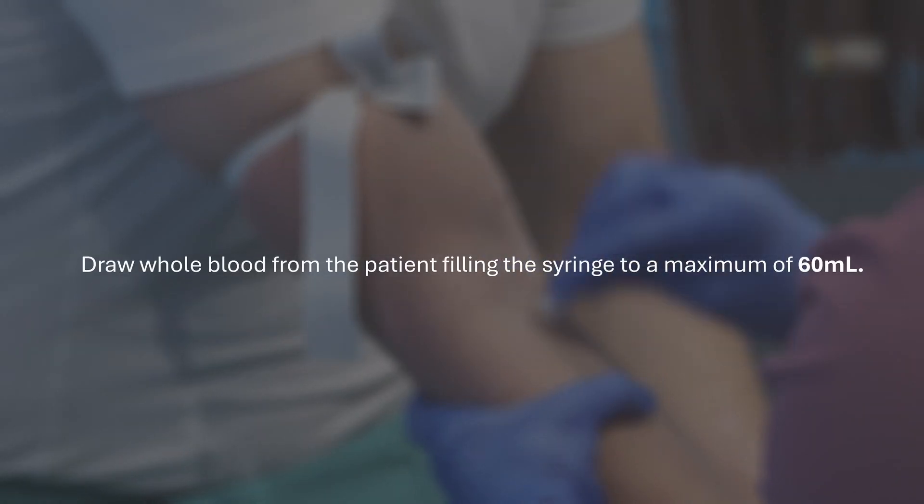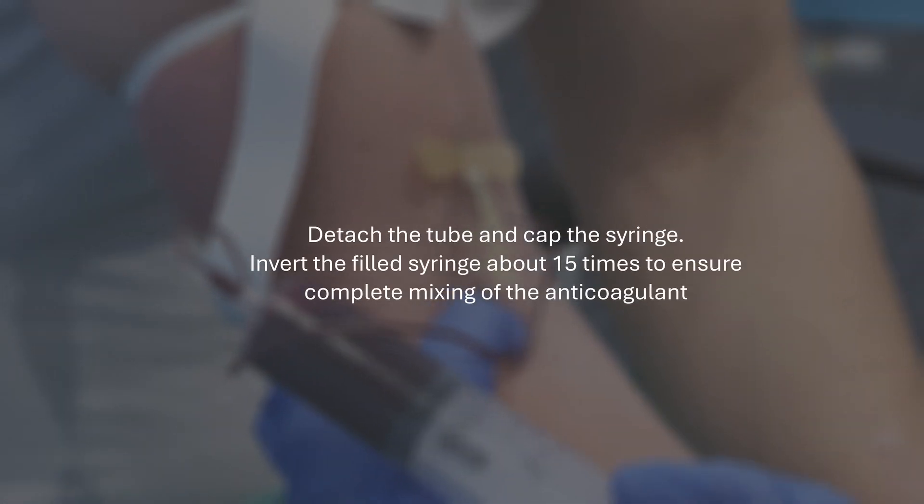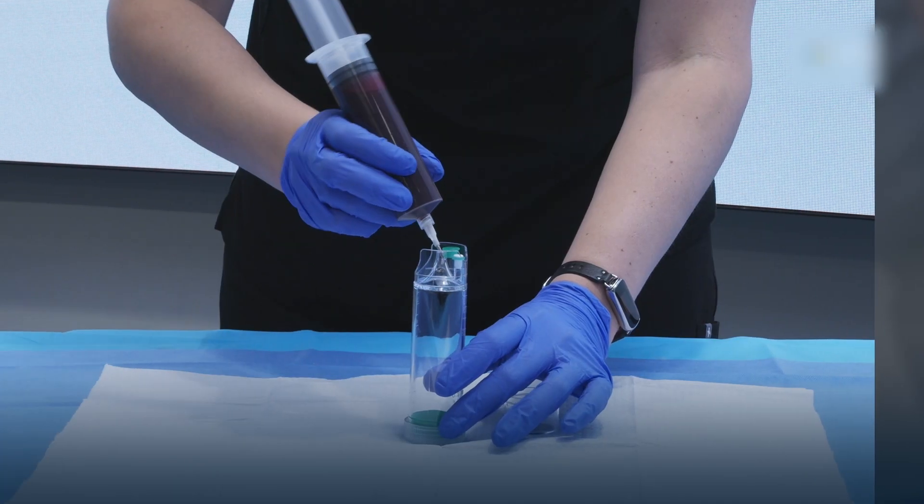Draw whole blood from the patient, filling the syringe to a maximum of 60 milliliters. Detach the tube and cap the syringe. Invert the filled syringe about 15 times to ensure complete mixing of the anticoagulant.